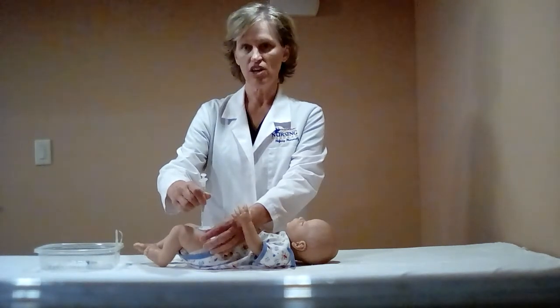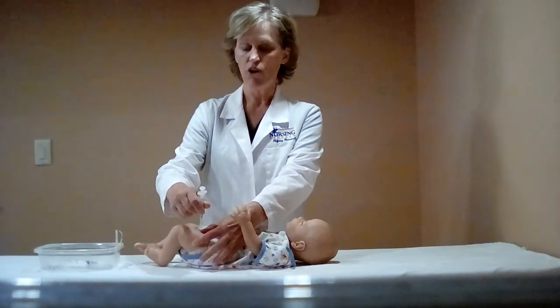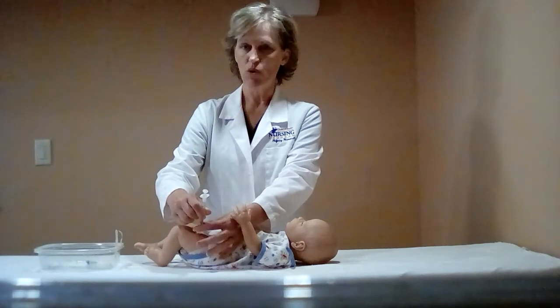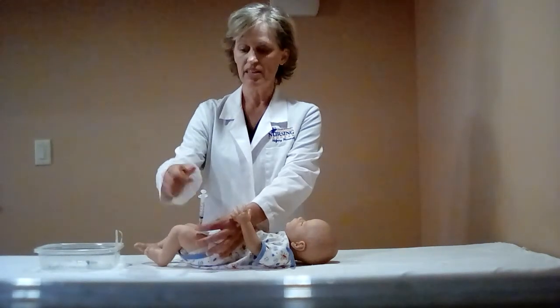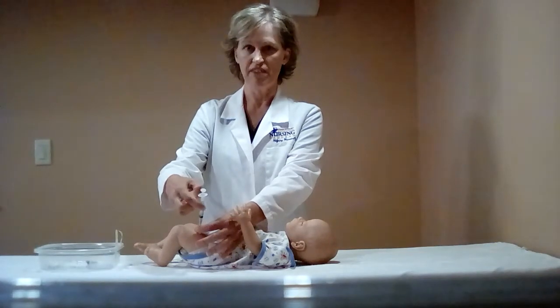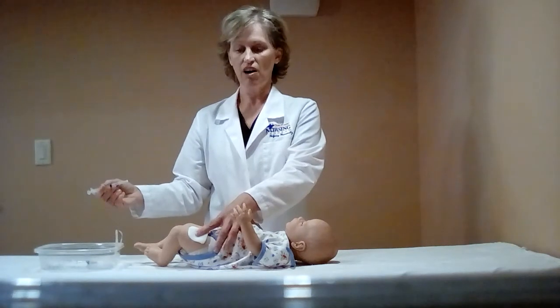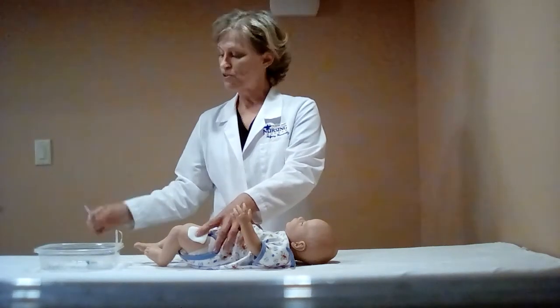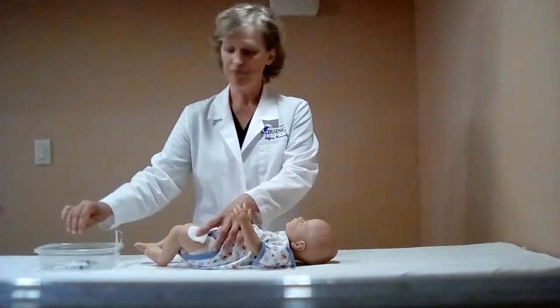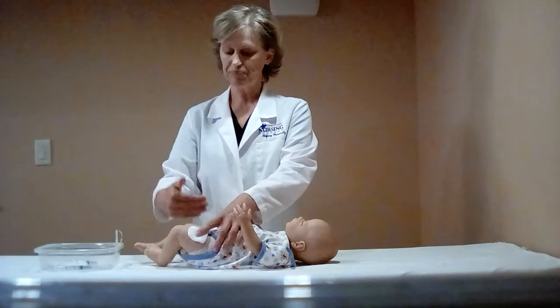For an IM injection, you will spread the skin so that it's taut, and you will go in at a 90-degree angle. Then you will anchor the syringe at the base and press the plunger the whole way in so that the child gets all of the vaccine. As you remove the syringe, I will place pressure on the site with the gauze, so that you can put the safety on the needle and place the syringe in the tray. Then you will grab the next syringe and continue the process.